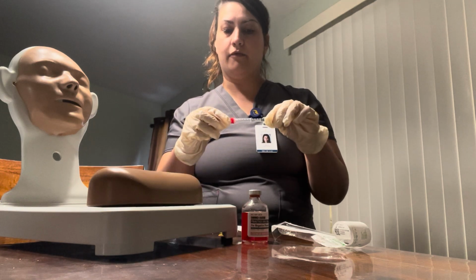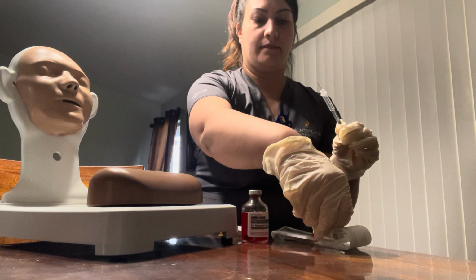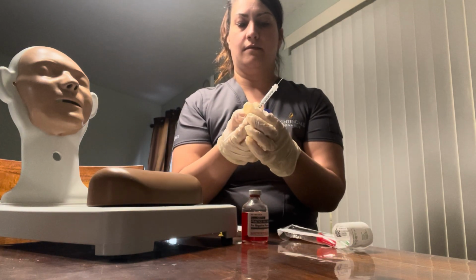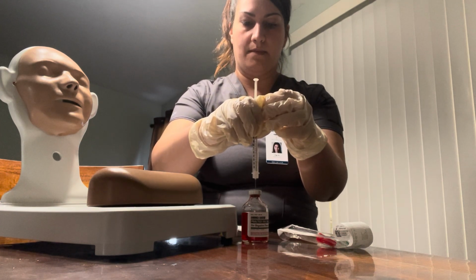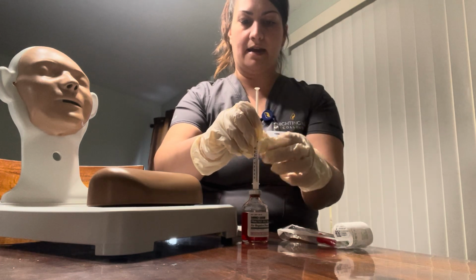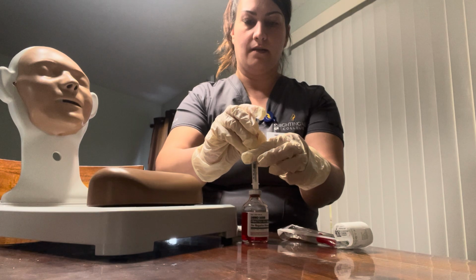Next, I will remove the cap. Put it in the vial and make sure that I don't touch the medication. I will push the air into the vial.